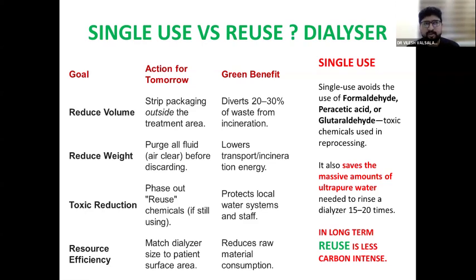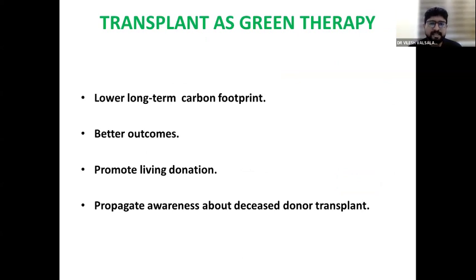But in the long run, when you look at the patient for the next 5 to 10 years, in long-term usage, reuse is less carbon intense compared to single use, because in single use you keep adding a dialyzer each time. So they found that for a long-term patient who has been dialyzing for 5 years and more, reuse has definitely been showing less carbon intensity compared to the person using single-use dialyzers.